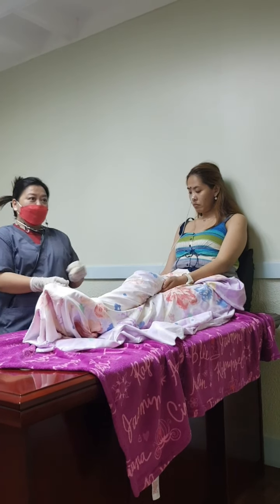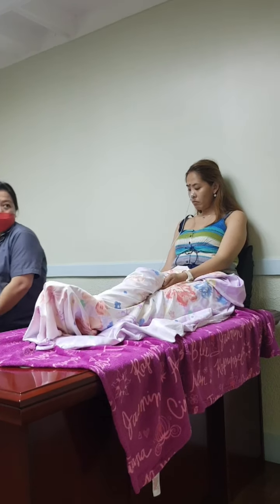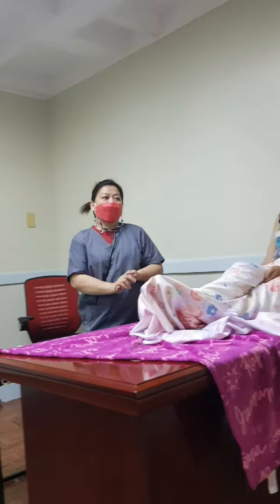Take off and dispose of the gloves. Perform hand hygiene. Replace and properly dispose of equipment to prevent the spread of infection and to prepare for the next procedure.